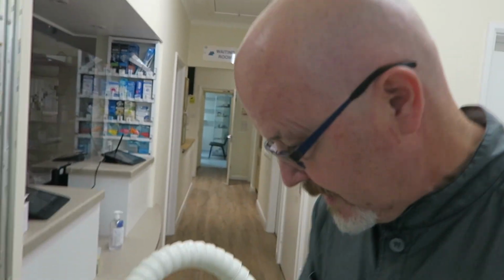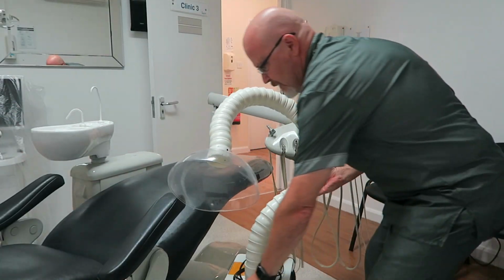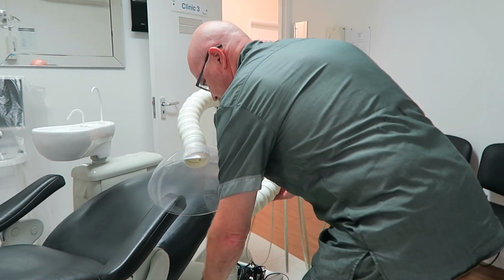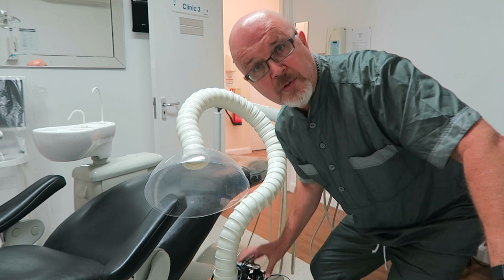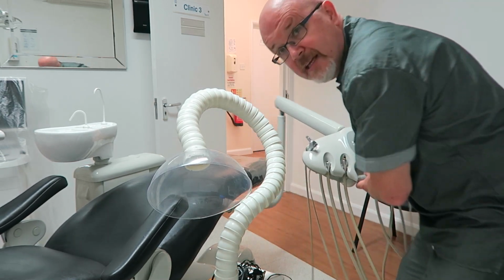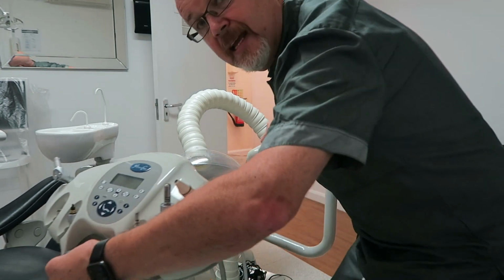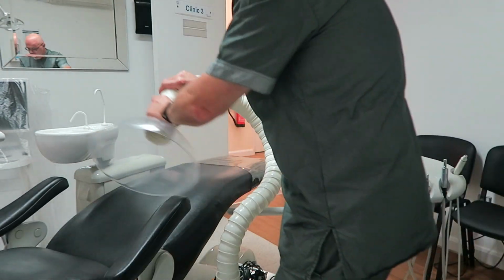Right, okay, so it's the turn of the VacStation now. Let's just wheel that in. We know it's going to go over here. I've tried the DentalAir, it's roughly the same size box, so all being well, that should be good. So I'll just position that now. And I already know from having put the DentalAir in, this has got to come quite close to the front to allow the delivery unit arm to come in around here like so.